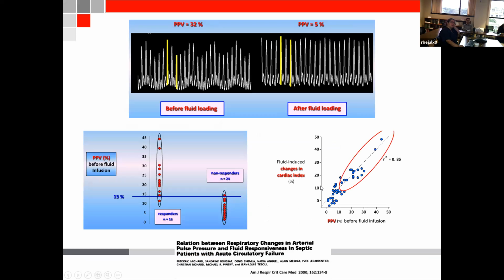You can do the same thing either with pulse pressure variation, and actually this was a correlation, if I remember well, between it and the Swan data, and they looked at the cardiac index as it increased the pulse pressure, just to show you that the correlation is perfect.